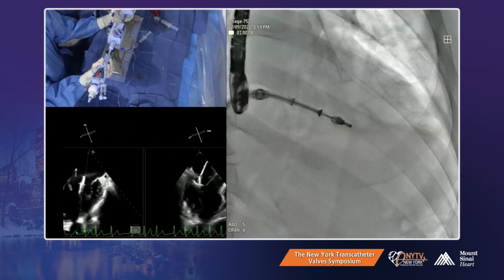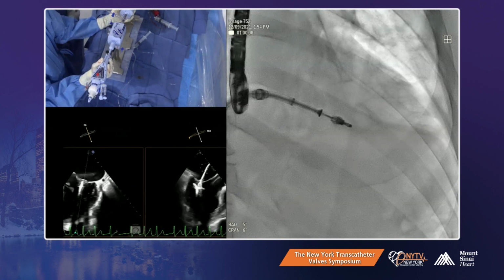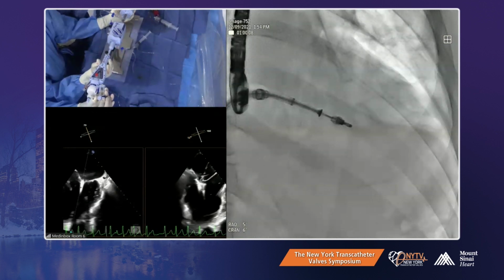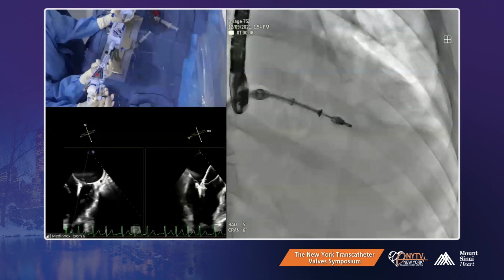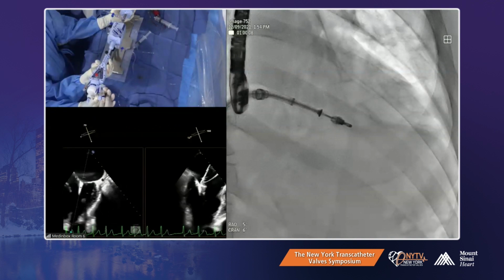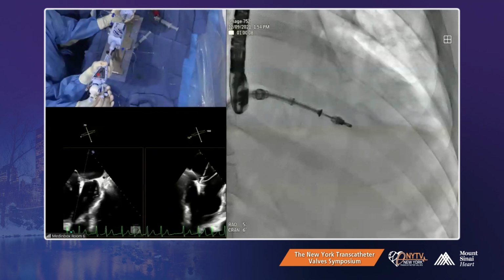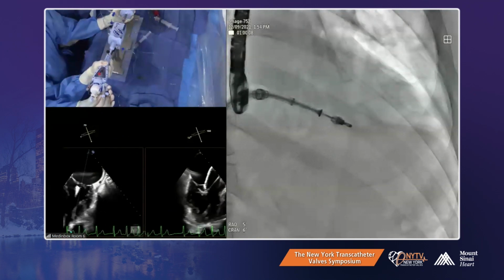Well, I think acute cardioversion is not going to work, right? You can't cardiovert because it's such a big atrium. Okay, ready? That's better. Samin, did you give any digitalis? Yeah, that's what we are getting now. Get 0.25 of dig. You could start a Cardizem drip. What is the Esmolol drip at?